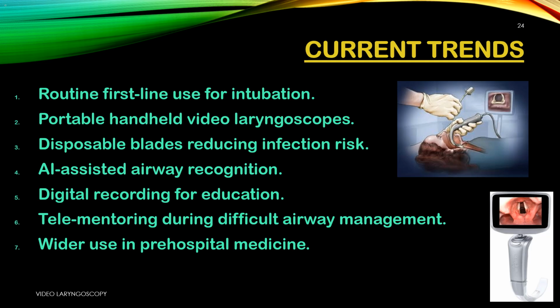4. AI airway recognition. New software can highlight the vocal cords and guide placement. Helps trainees and in stressful cases. 5. Digital recording for education. The video can be recorded and replayed. Used for teaching, audit, and skill review. 6. Mentoring during difficult airway management. Experts can watch the screen live and guide you remotely. Useful in low-resource or rural areas.